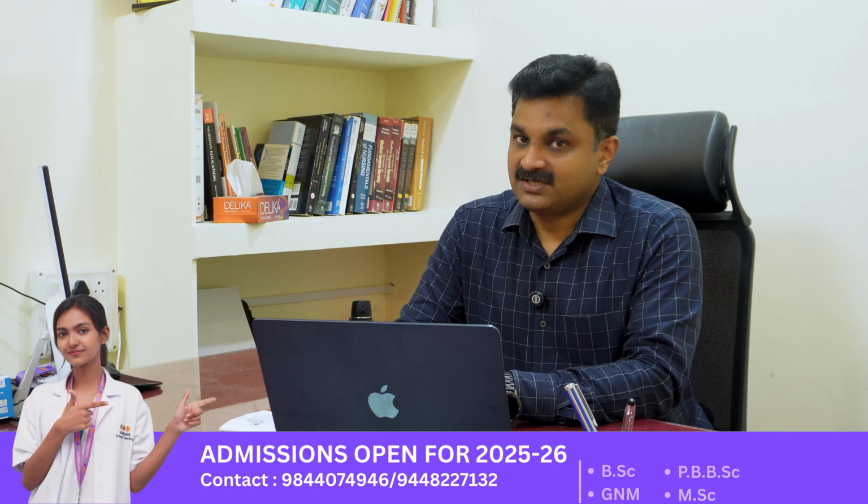In such a situation, the AED is not contraindicated, but you can see a visible lump-like part on the chest where the pacemaker is implanted. So never, ever place the pads of the AED on top of the pacemaker. Just below that you can place the pads, and proceed with analyzing the rhythm and with the shock.